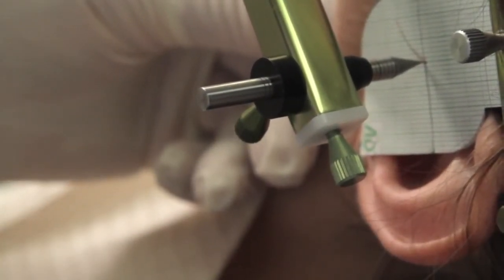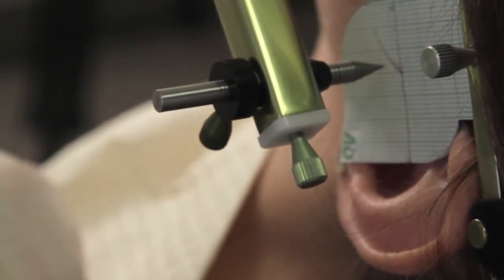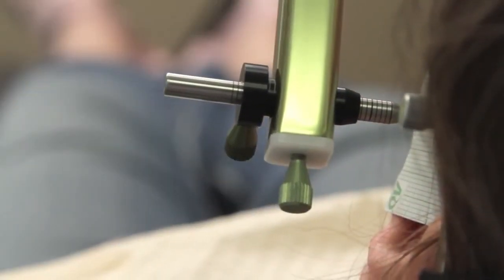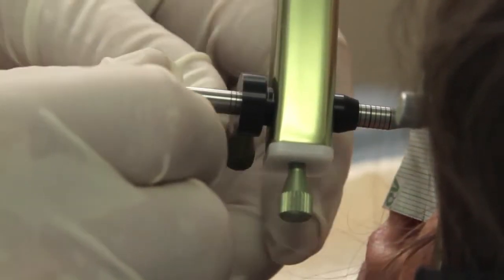Now move. Stop. There we see about 1.5 millimeters, so I'm going to do it again. Hold it. Now move. Stop. That's approximately 1 millimeter. So using the bullet, we also measured approximately 1 millimeter side shift.